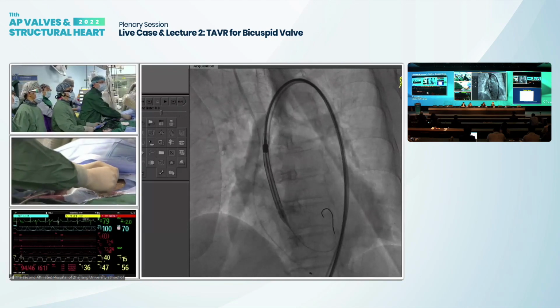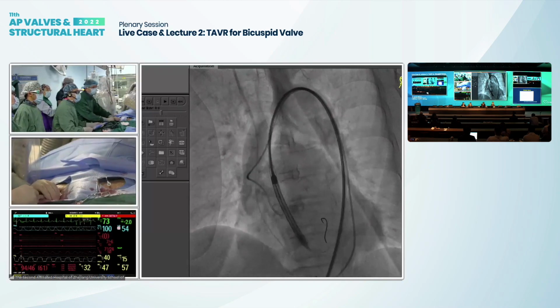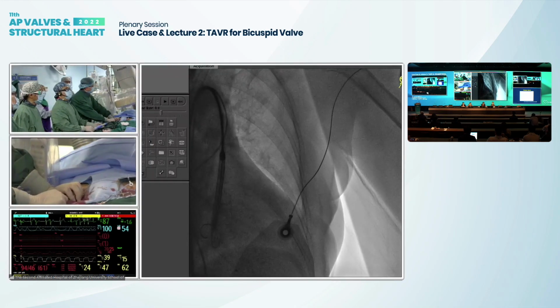Okay, we go back. We need a cusp overlap view.